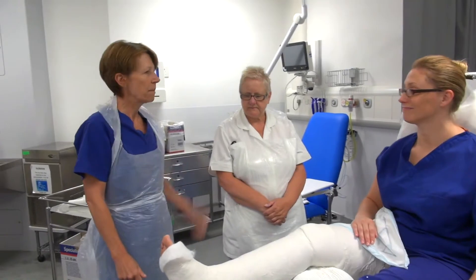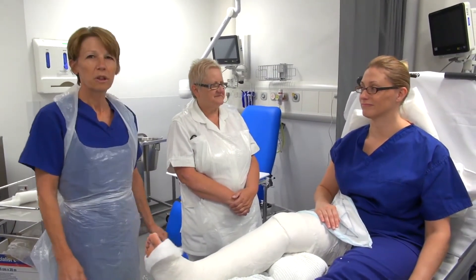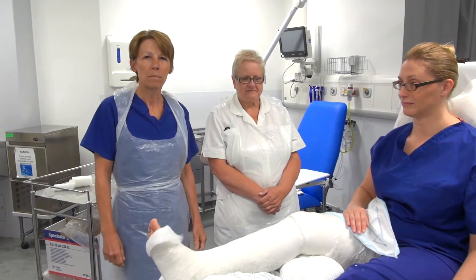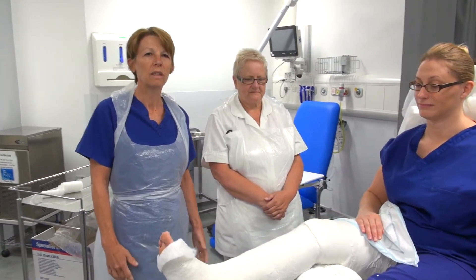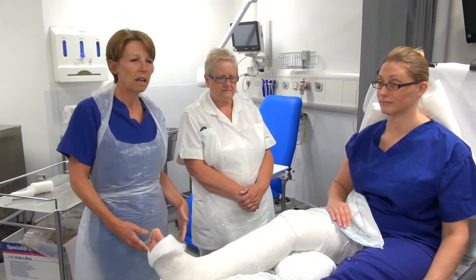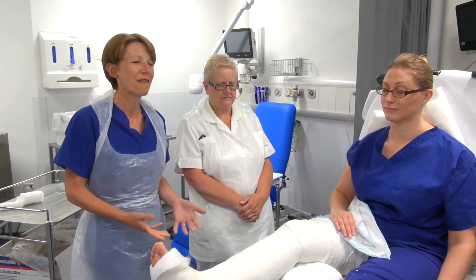I'm Sue and this is Pam, and our model is Ann today. We're going to demonstrate how to put on a hanging cast. A hanging cast is applied for a proximal fracture to the humerus which is displaced. The weight of the cast will allow for proper alignment of the humerus fracture and also disimpaction of the fracture.